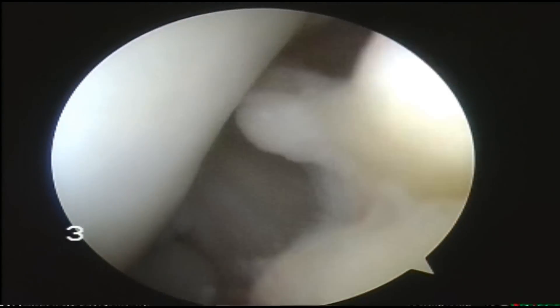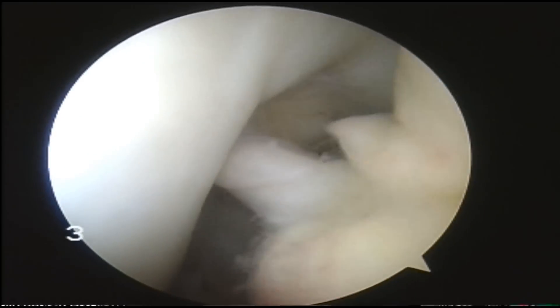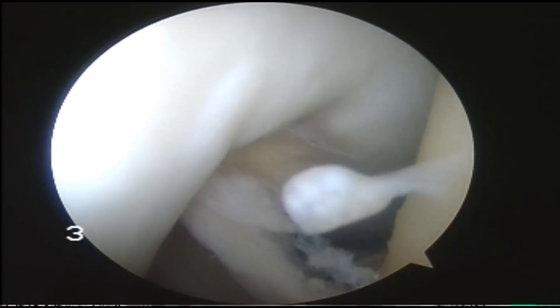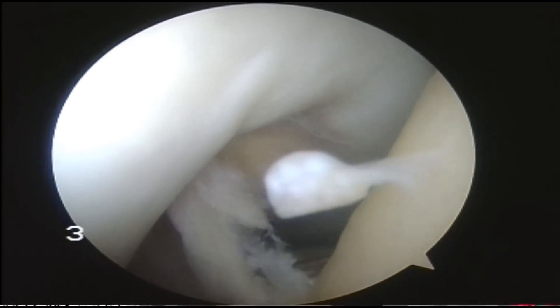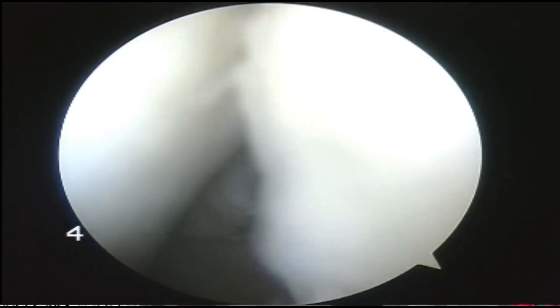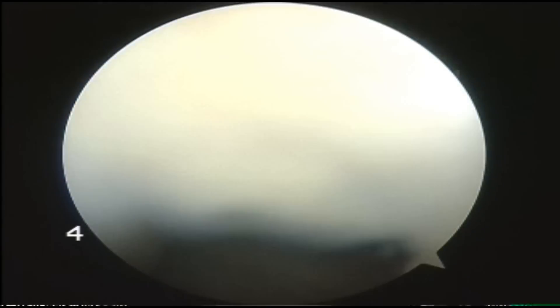I think the key to the operation is also to remove the infrapatellar plica which holds it down. Here you can see one of the synovial protrusions producing these loose bodies. I'll remove that at the same time.